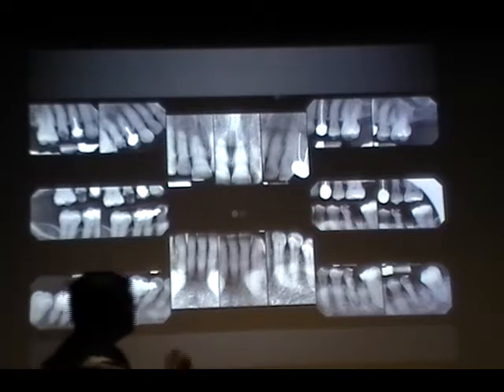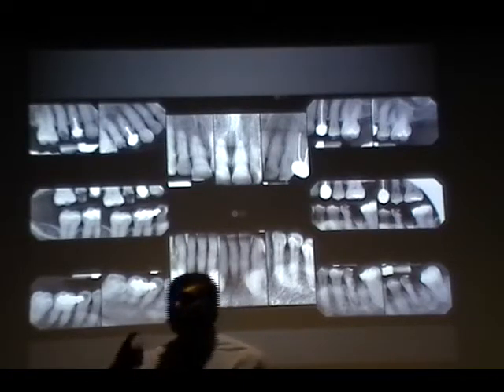It cuts off the apex. Yes. But you got the distal canine. Yeah. Beautifully, right? But the apex has been shot off, yes. Next. Abdul.